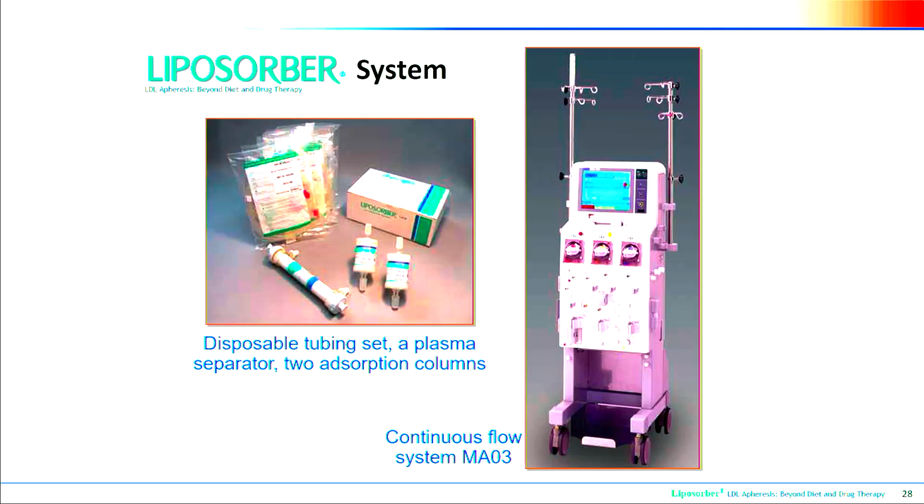This is the machine. I must admit, as a cardiologist, I'm not an expert on the machine, because my colleagues in the transfusion medicine center run this, and I wouldn't be able to tell you I've turned all the buttons and everything on the machine. But this is what it looks like, and it kind of reminds me of a dialysis machine. When our patients come in there, I'd be curious to hear thoughts as well.